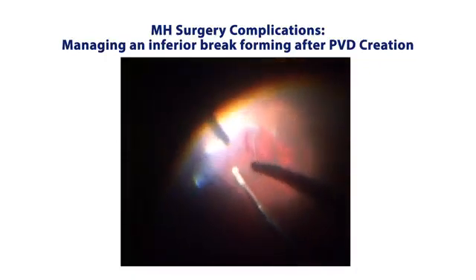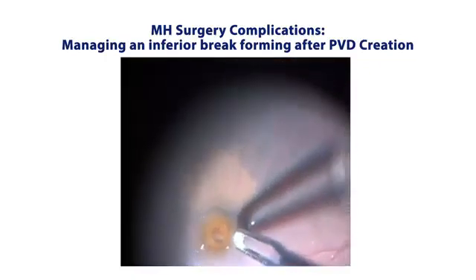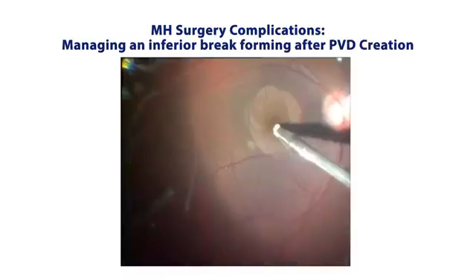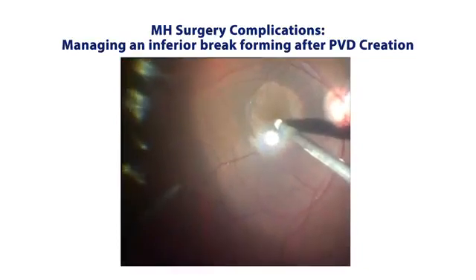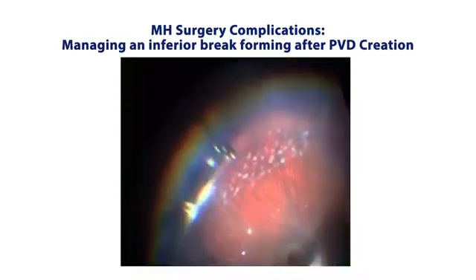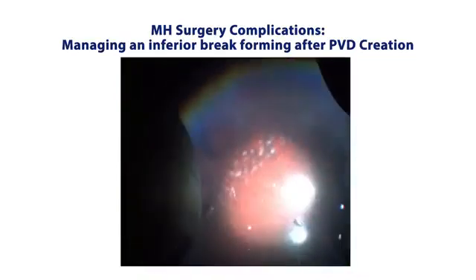So the main aim is to remove the vitreous from there. After that, you carry on with the macular hole surgery steps one by one, and once you finish, at the end of surgery, we do laser barrage to that whole area so that the patient does not come back with a retinal detachment. At this stage, I will let Harvey take over and show you some more examples of complex macular holes and how he uses adjuncts to deal with them.